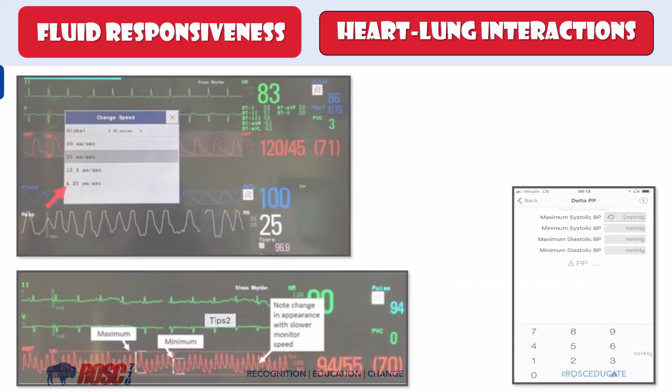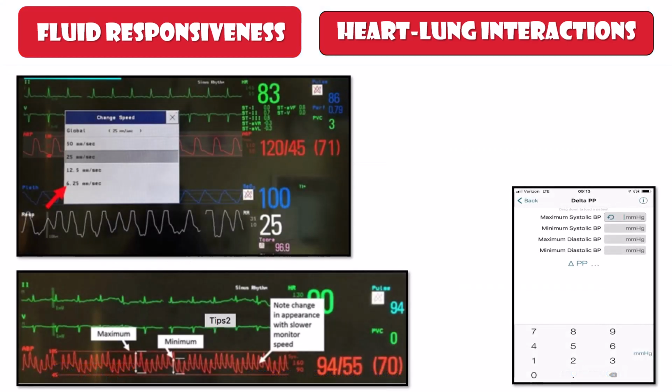Here's an example of doing just that. I've gone up to my hemodynamic monitor. I've changed the speed of my arterial waveform down to 6.25 millimeters per second. I then froze my frame. I've recorded the maximum systolic pressure, the minimum systolic pressure, the maximum diastolic pressure, and the minimum diastolic pressure. Instead of doing this calculation by hand, I use a leading brand medical phone app, and this allows me to determine pulse pressure variation at bedside.